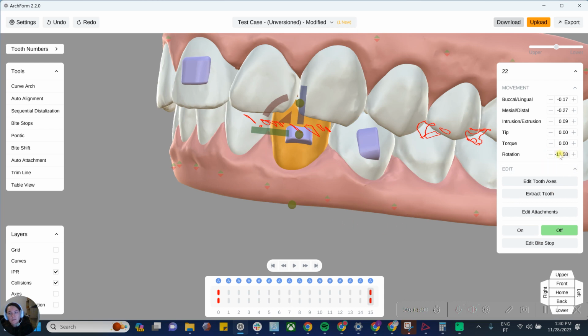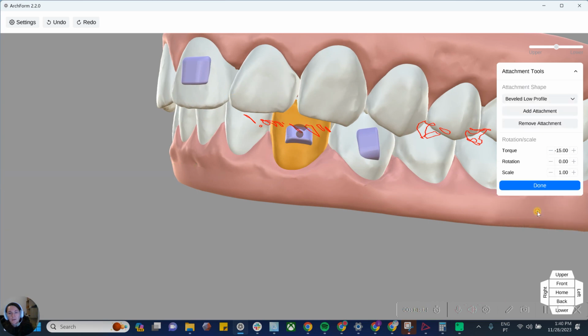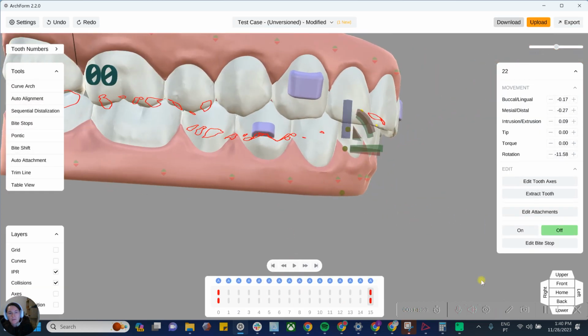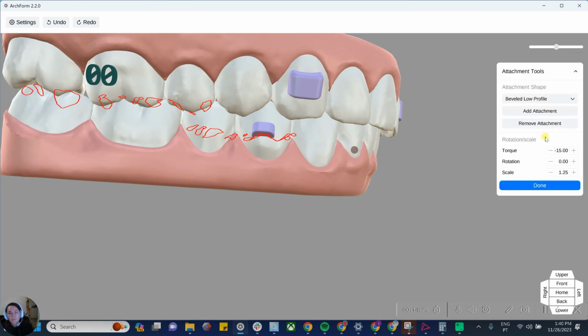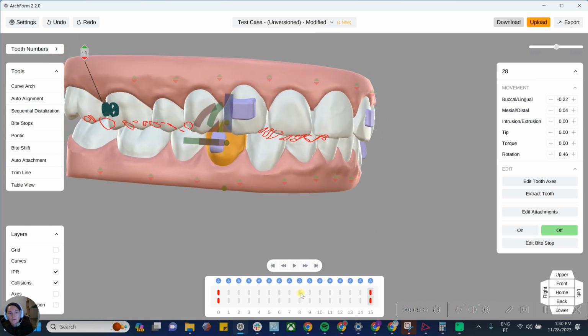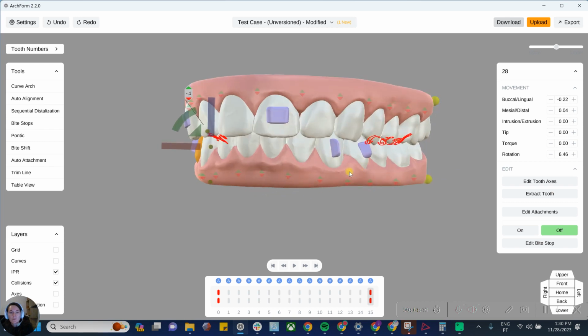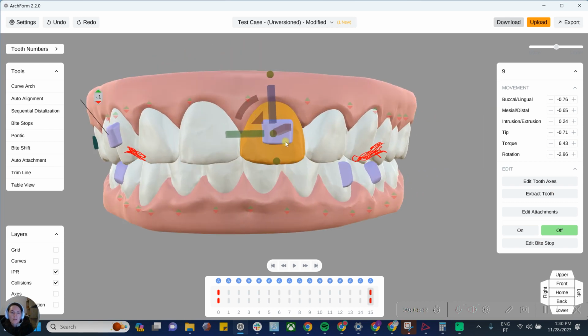So you can see here we're trying to support this rotation. Obviously, the direction that the bevel faces in will be your preference or your doctor's preference. So you can just assess that for yourself. In this particular case, I'm just having the bevel face towards the pushing side.